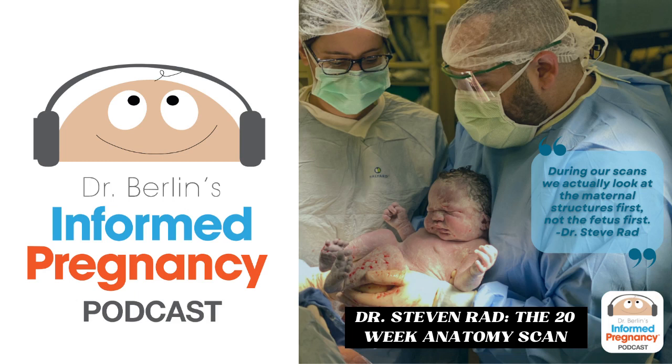So we make sure that the abdominal wall is completely closed, and we look at the umbilical cord at that, it's your belly button, but it's all closed up and looks nice. And then we go down a little bit lower. We'll go to the pelvis and we'll see the fetal sex, which will let you know if you want to know or hide it. And then we look at the legs.